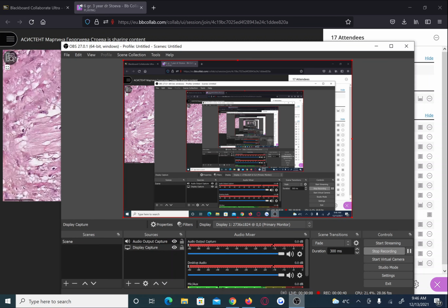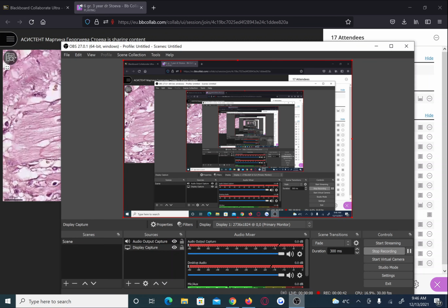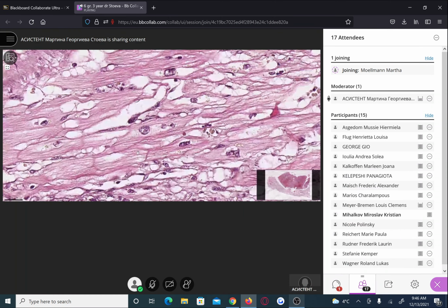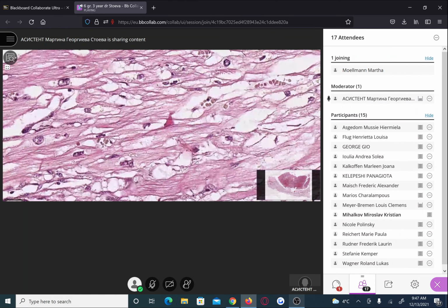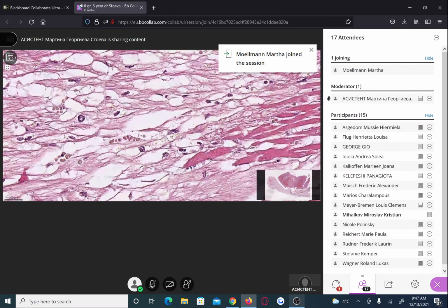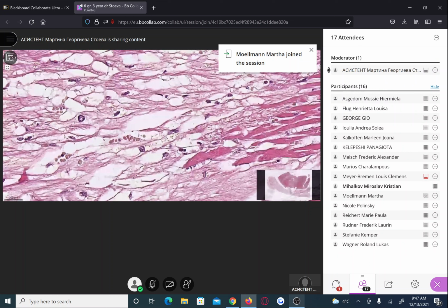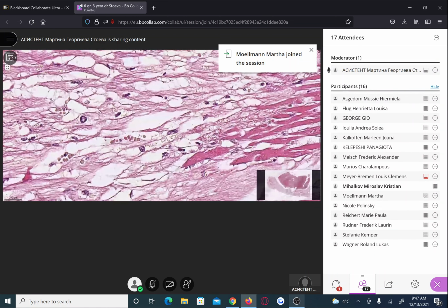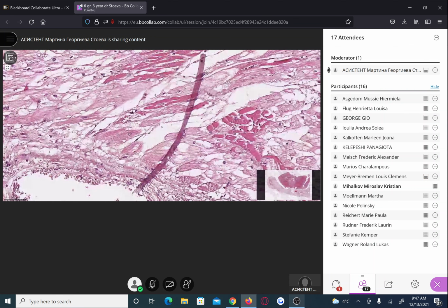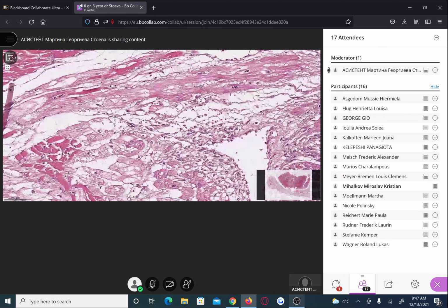Another thing that is obvious is the granular yellowish pigment surrounding the nuclei. This is lipofuscin. You know that this pigment is formed due to aging. Here again, it is seen in almost any cell. Due to aging, because of the lipid oxidation of the cellular membrane, phospholipids.